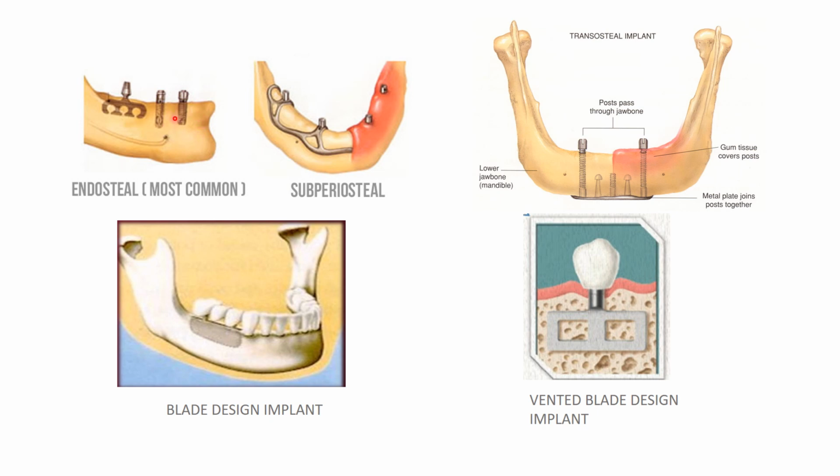95% of the implants. You can see here we have subperiosteal implants in which first the flap is completely reflected, the bone is stripped of the periosteum both lingually and buccally and labially, and then a bone level impression was made initially when there was no CAD/CAM and no intraoral scanners, which was very difficult and cumbersome, and over that model a subperiosteal implant was fabricated in this way, and this implant was anchored to the bone using small titanium screws, and these were the abutment heads which were poking out of the implant or out of the gums on which the prosthesis was cemented.